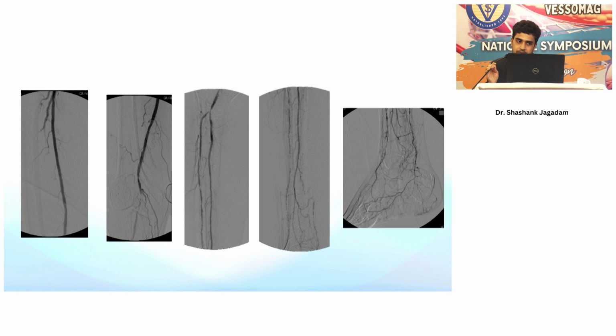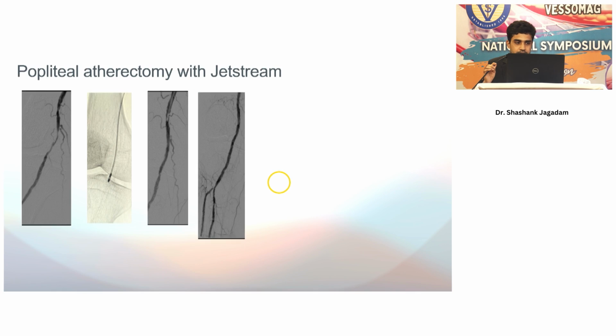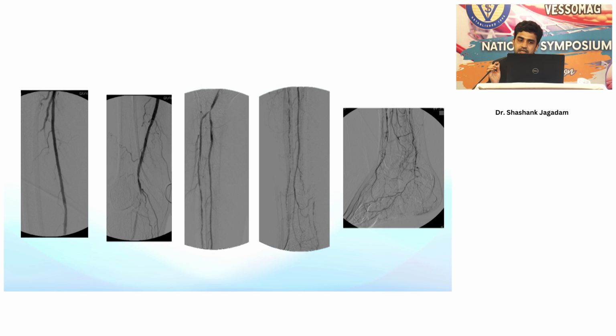So we went ahead with an on-table angiogram and proceeded. Angiogram showed non-flow limiting stenosis of the distal SFA and P1 popliteal, and P2 chronic total occlusion. P3 had a short segment stenosis just above the bifurcation. Peroneal was the dominant flow into the foot, forming collaterals to the ATA and PTA, which were diseased.